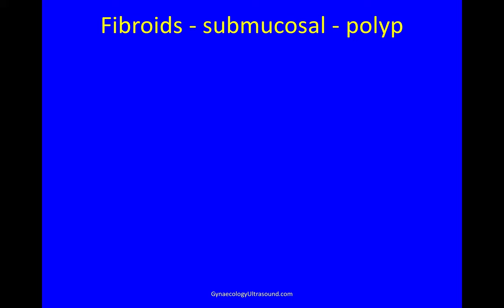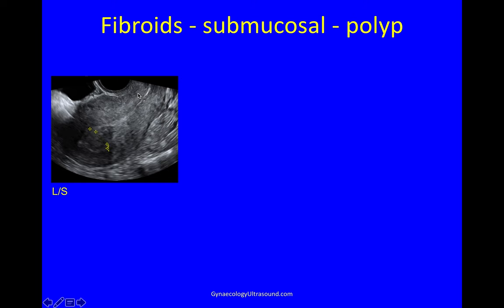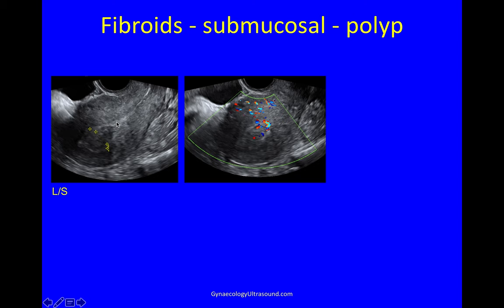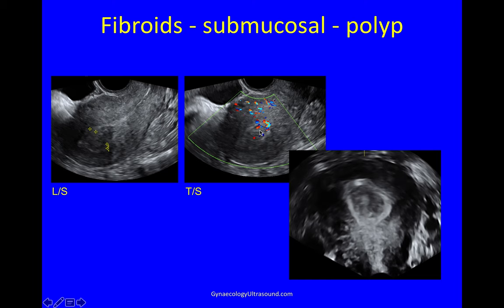A fibroid can jut further into the cavity — in this anteverted uterus this hypoechoic regular mass seems to be surrounded by endometrium in all directions. Going transversely you can see endometrium all the way around and a feeder vessel — so this is a fibroid polyp. On 3D it shows up really nicely because it's hypoechoic and the endometrium surrounding it is hyperechoic. This is a fibroid polyp, submucosal G0.